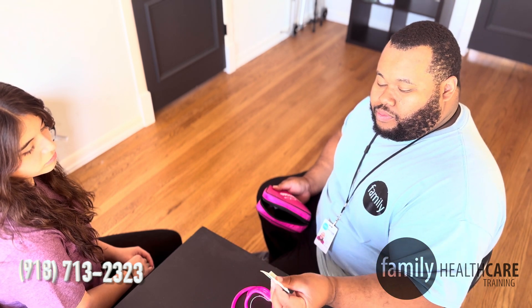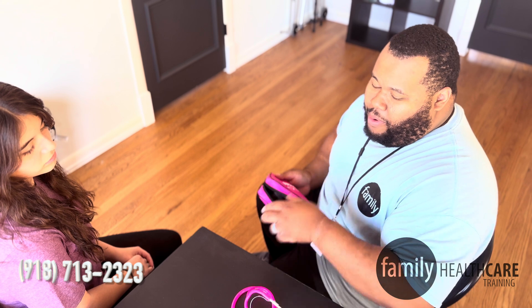Alright guys, my name is Gabriel and today we're going to be going over another skill. The skill we're going to be going over is blood pressure. In order to do a blood pressure, we need our blood pressure cuff, a stethoscope, and two alcohol packets.